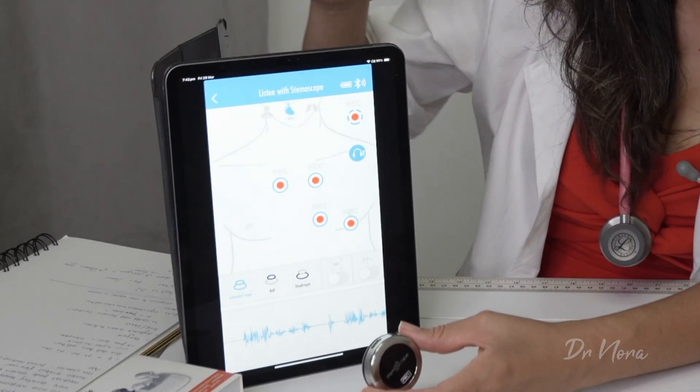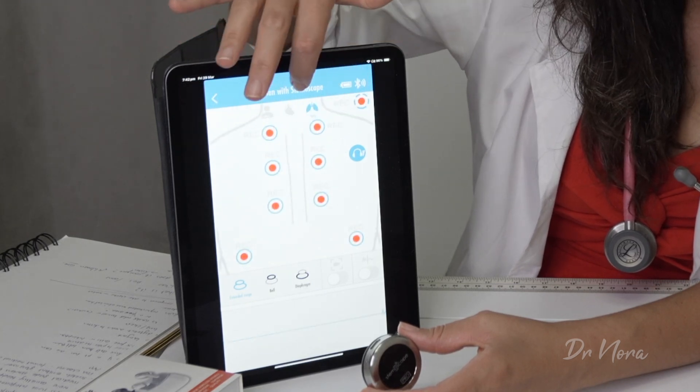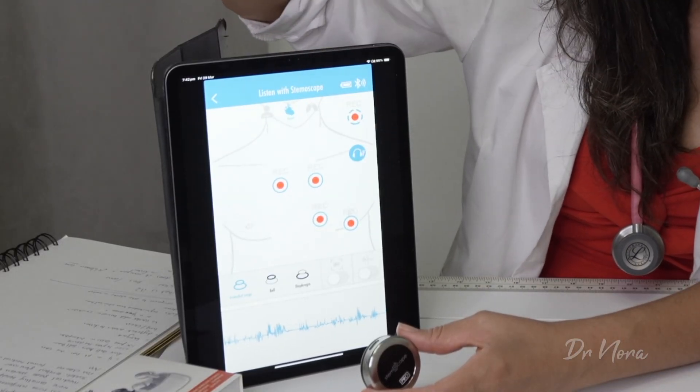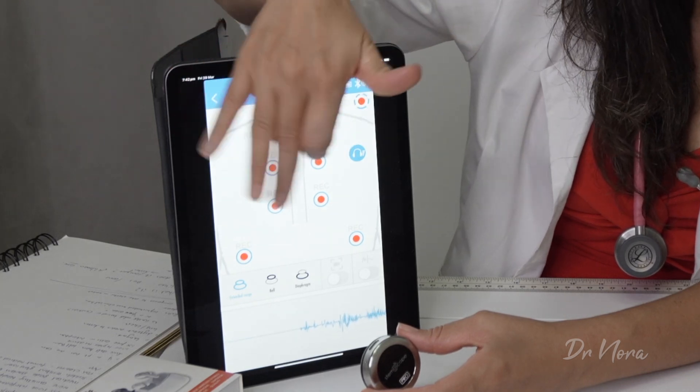Now, when you are listening to your patients, you can actually toggle between the heart and the lungs, and you can record the different areas that you've listened to. For example, if I'm listening to the heart, I can take a listen to the mitral valve and I can record that. And with the lungs as well, I can listen to the upper lungs, middle lungs, or the lower lungs, and I can record those areas too.